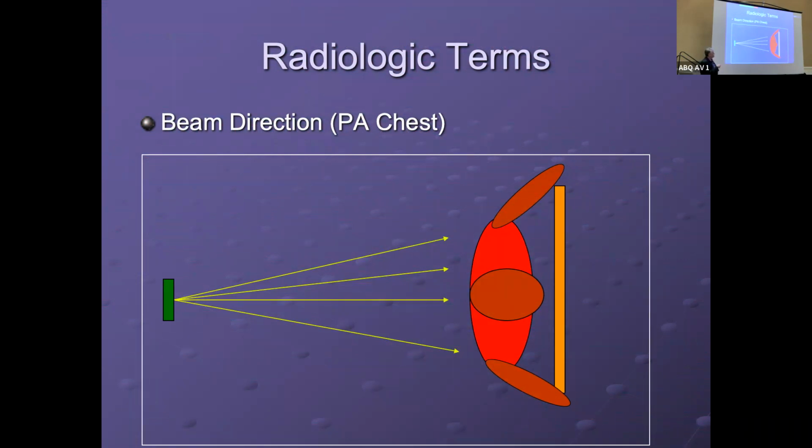When you do an X-ray here, you're going to have the film right here, and basically the front part of their chest is going to be close to that film. Now, the heart is going to be right here towards the front, and you can see the beams pass through and reflect and bounce off this film and come back out. And that's what's read on the X-ray.